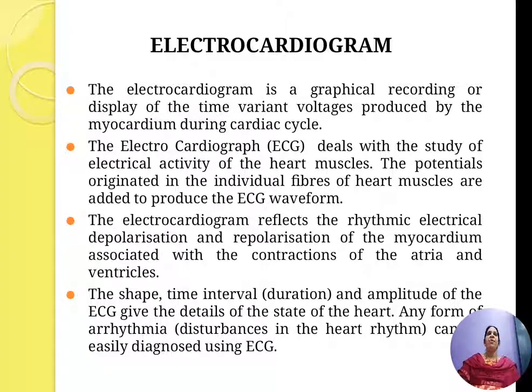The electrocardiogram reflects the rhythmic electrical depolarization and repolarization of the myocardium associated with the contraction of atria and ventricles.